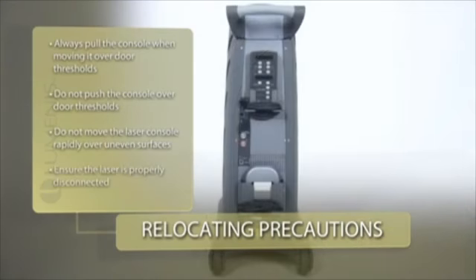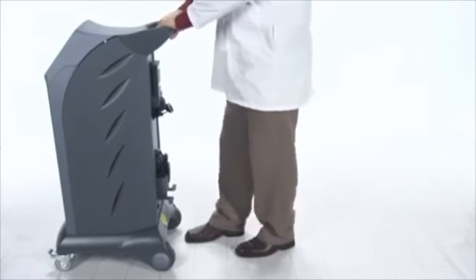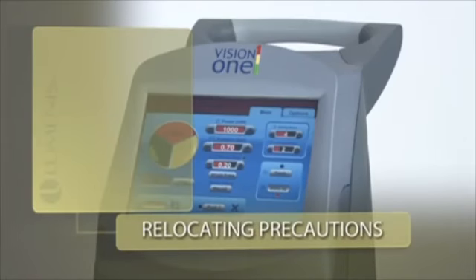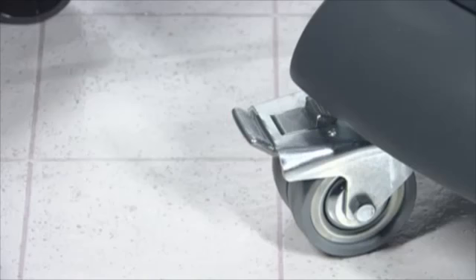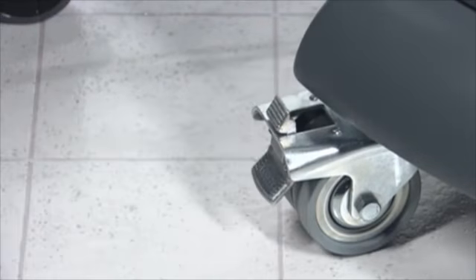When you're ready to move the console, ensure that the laser is properly disconnected as instructed previously. Next, unlock the laser console wheels by pulling up on the front wheel locks and, using the laser console handle, move the laser to the desired site. Do not position the system closer than 13 centimeters, 5 inches, from walls, furniture, or other equipment. Adequate space around the laser console ensures proper air circulation for system cooling. Finally, remember to lock the laser console wheels by pressing down on the front wheel locks.